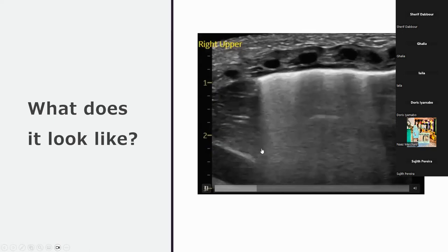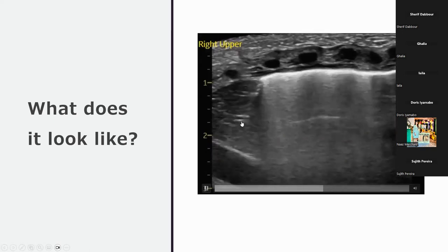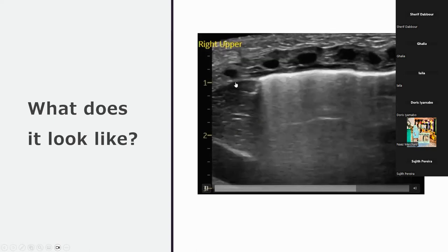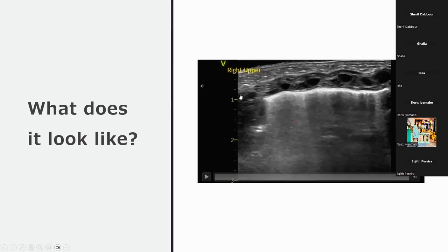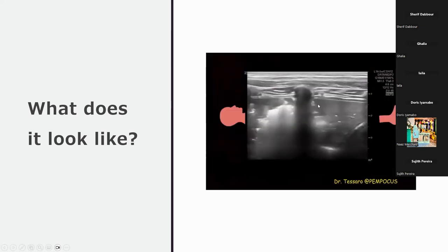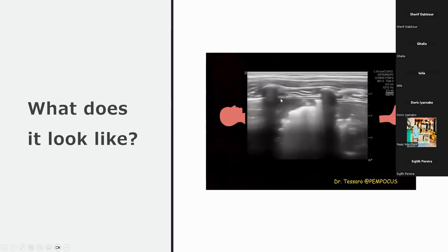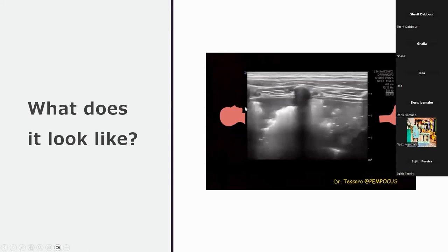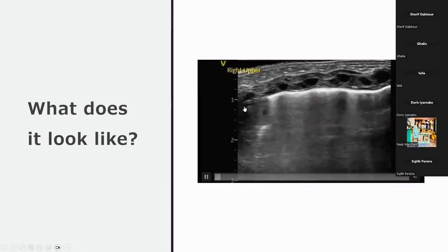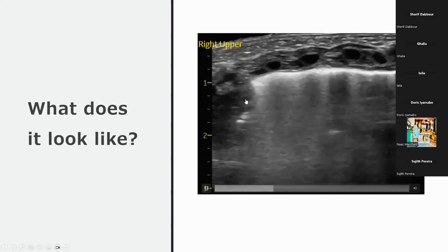Right upper lobe. Can you see how triangular it is, you can see these parallel air bronchograms, but I can't see any established pleura there. Can you see? There's no established pleura there. Whereas when I look over here, can you see how there's established pleura there? Can you see that? Yes. So fractal sign will usually have those margins. And again, you're putting a number of signs together to try and make that diagnosis.